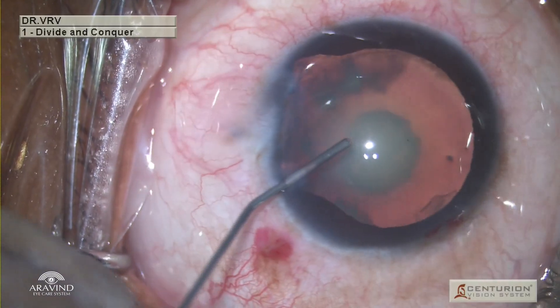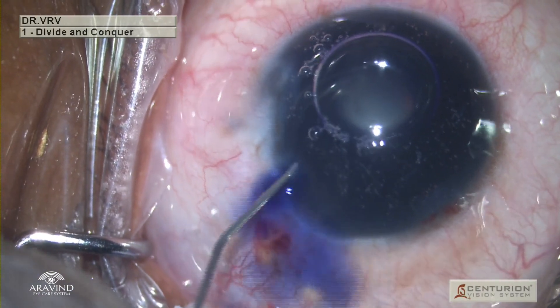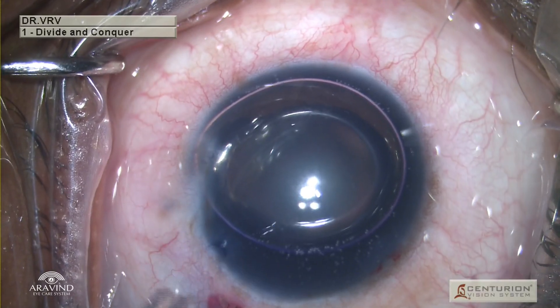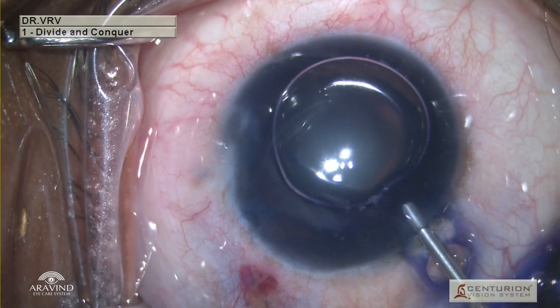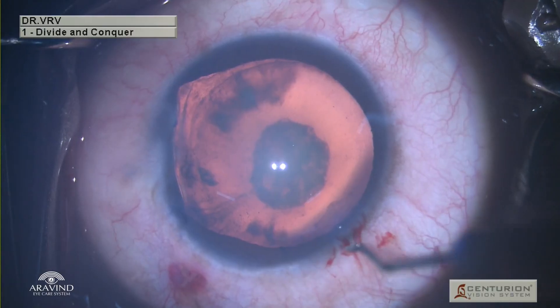Once this step is done, intracameral trypan blue is injected following an air bubble, and then a second air bubble is injected so as to paint the trypan blue properly onto the anterior lens capsule. The dye is left to stay in the eye for a few seconds and then viscoelastic is injected into the anterior chamber to remove the dye and the air bubble.